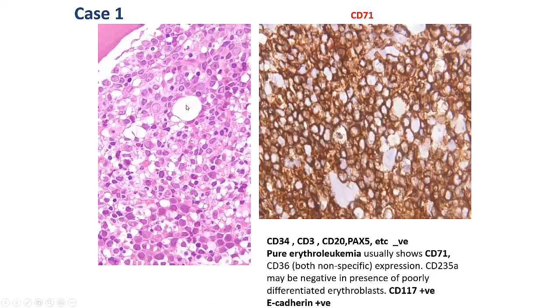This is the biopsy, and what the biopsy shows is sheets of these blastoid cells. You can see the prominent nucleoli in these cells, and there are very, very few eosinophils, but mainly it is the cells. Megakaryocytes are diminished. Very few polymorphs are seen. The myeloid cells are diminished. The erythroid cells are diminished. So we know it is an acute leukemia.